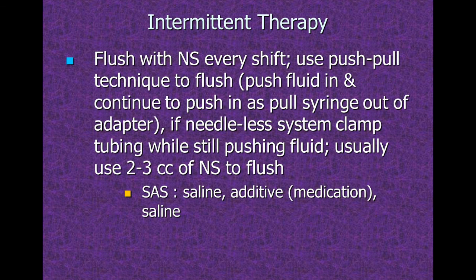With intermittent IV therapy, again, remember to flush with normal saline every shift. Use push-pull technique to flush. If you have a needleless system, you need to clamp the tubing while still pushing fluid, usually using 2 to 3 cc's of normal saline to flush.